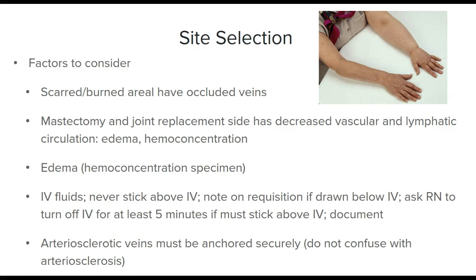Okay, whenever you go to stick, you need to pay attention to what you're doing. Look at the patient's arms. Make sure that you pick a good place. You don't want to use any area that has bad scars or burns, where you can tell that something has happened there. They may have veins that you can't get to.